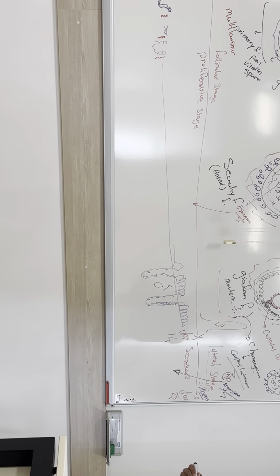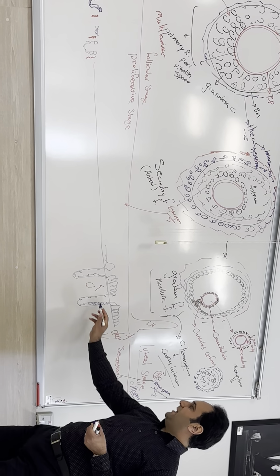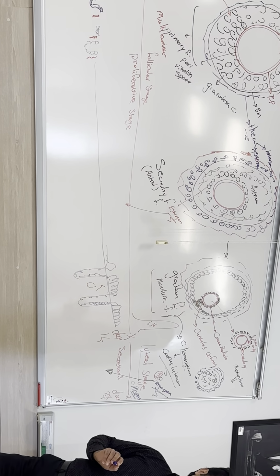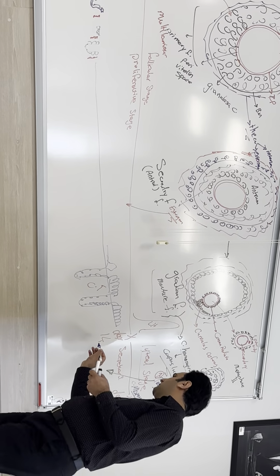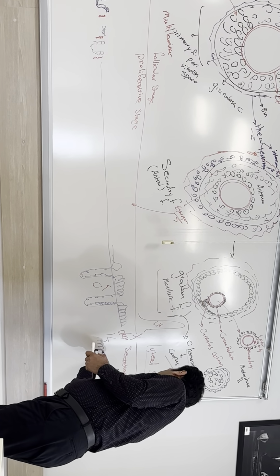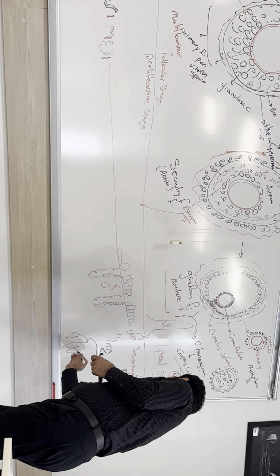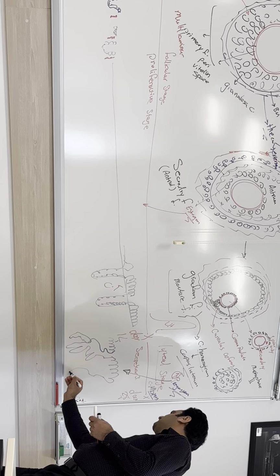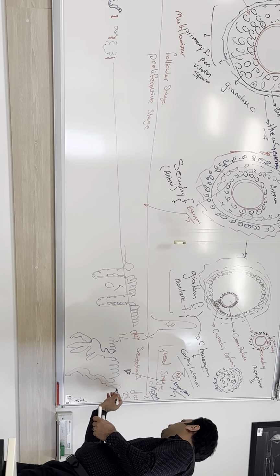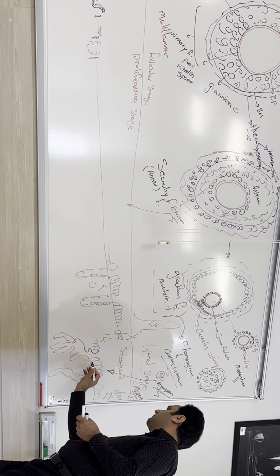And under the surge of progesterone, the glands of endometrium start to convolute. We have epithelium again like this, and glands form a structure like this. This is the basement compartment.